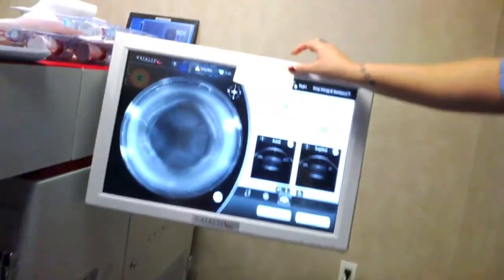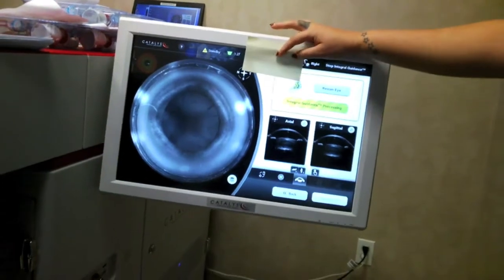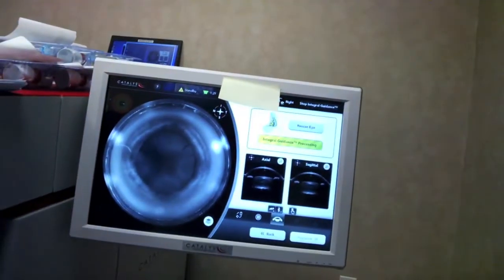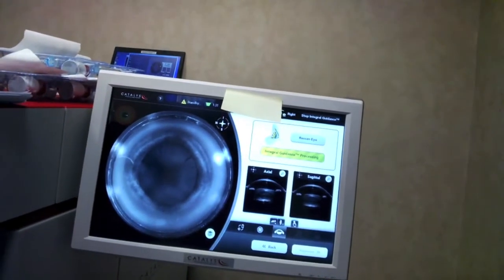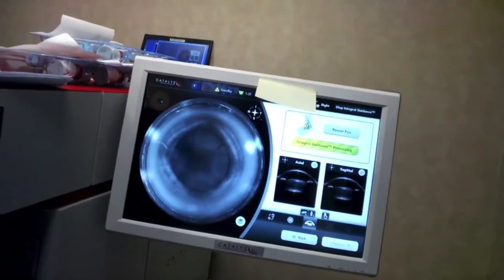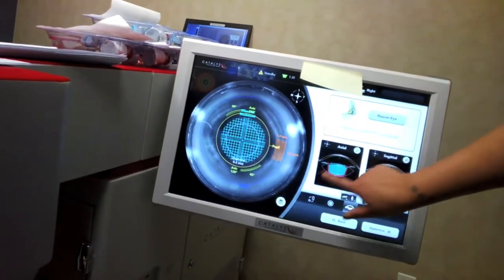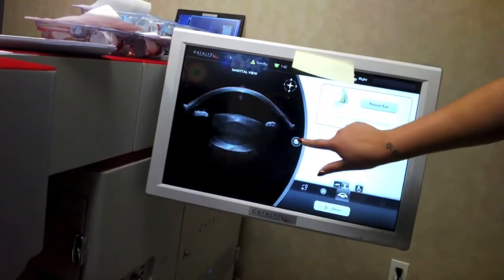How are you feeling? Good. We're almost done with those images and we'll get started. You're doing really nicely.